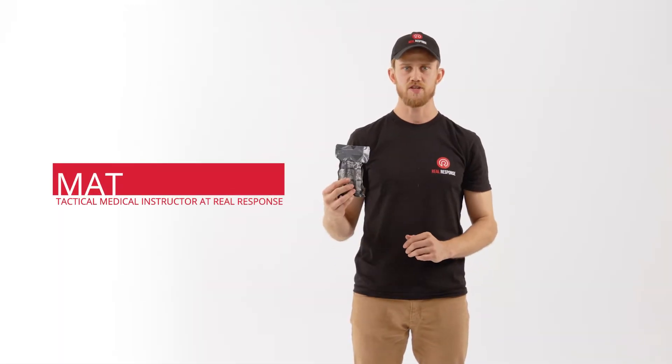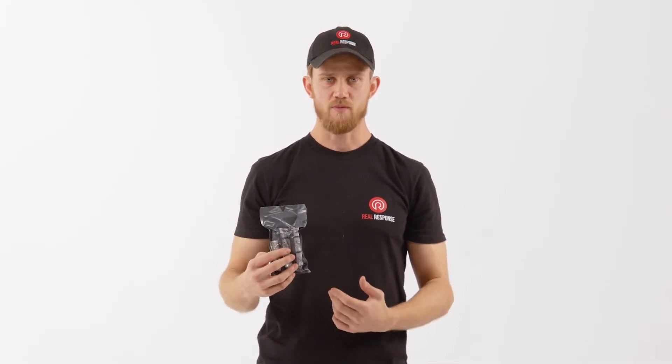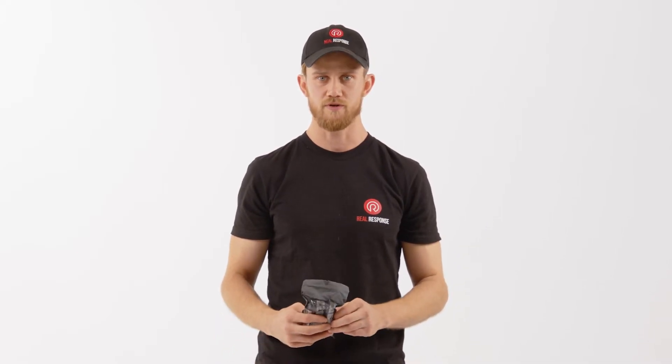What we have here to start off is the emergency bandage, or as you might know it, the Israeli bandage. Its application is for hemorrhage control anywhere on the body, including the head, the neck, the arms or legs, as well as the torso. This can be self-applied as well in cases where there's no one else to help you.